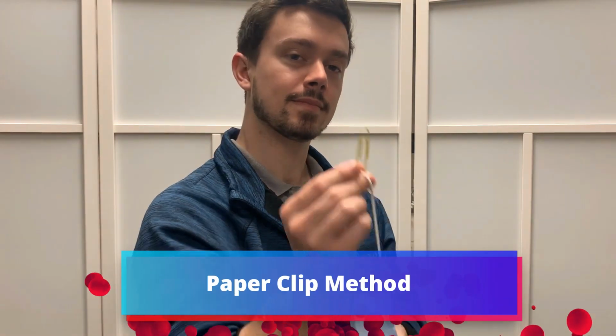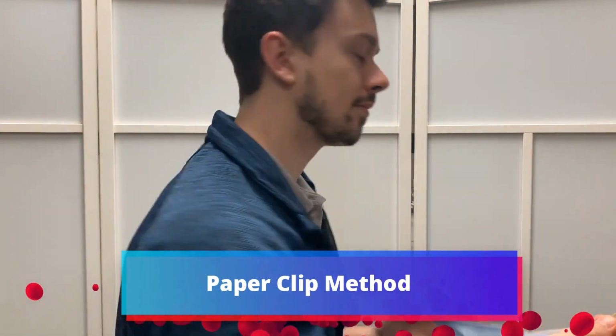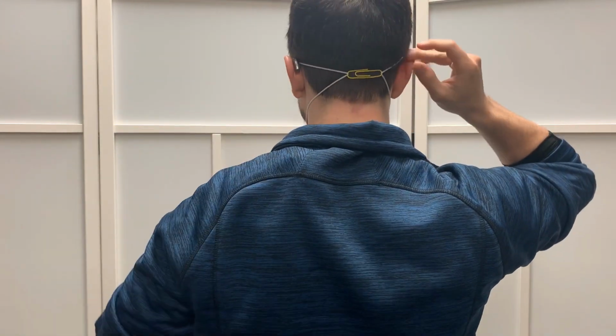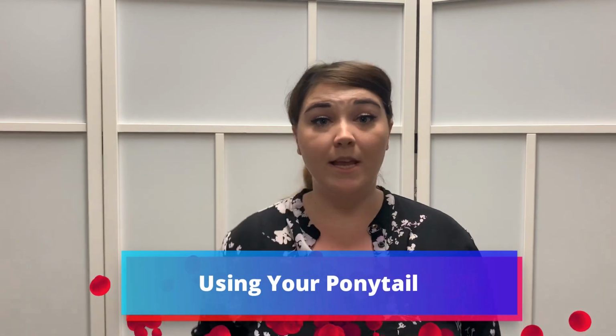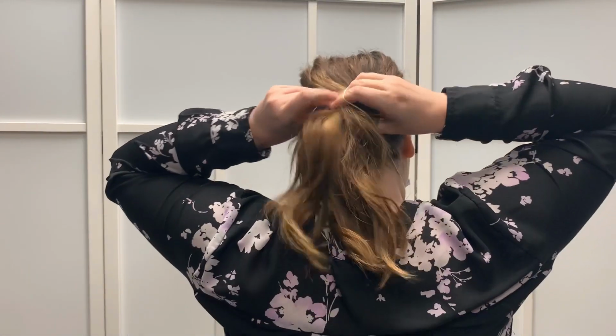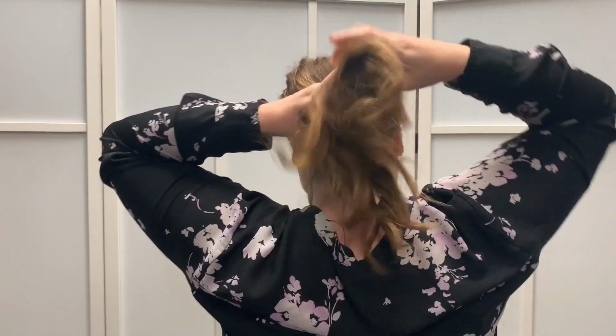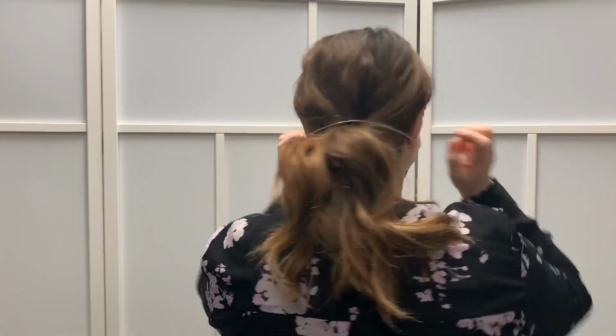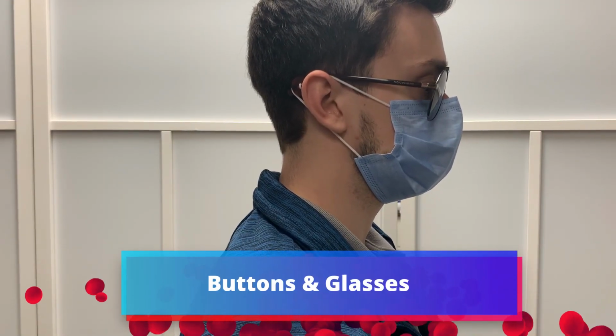An alternative to the ear saver is a paper clip. Another alternative, if you have a lot of hair, is to actually use your ponytail. The last alternative that we have, if you wear glasses, is to use a button.